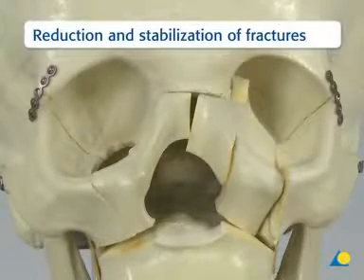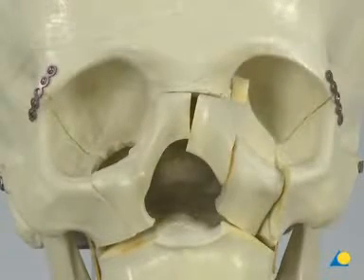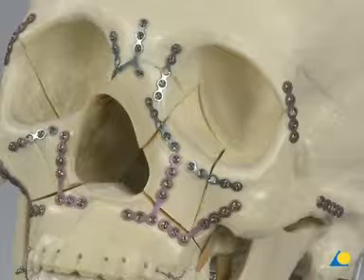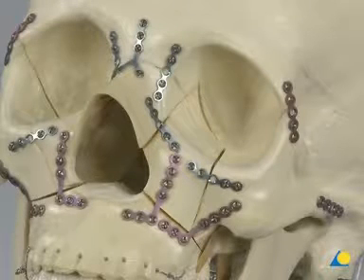Reduction begins at the zygomatico-frontal suture. The outer facial frame should be reduced and stabilized prior to naso-orbito-ethmoid and internal orbital reconstruction. Reduction progresses downward to the LeFort I level.